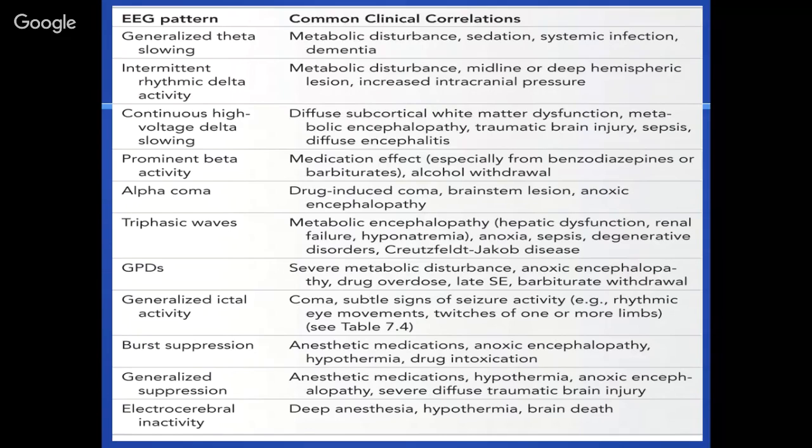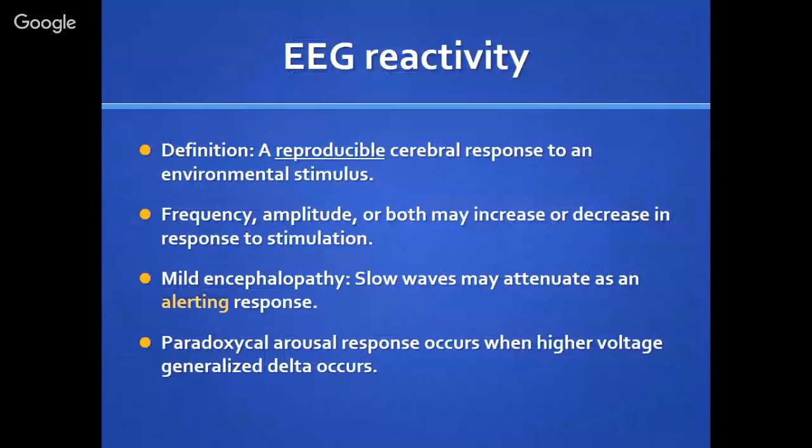And I also saw a patient with severe hyperacute liver failure, right? So no activity in the brain. Then after the transplant, they started seeing the activity. All right, EEG reactivity. So this is an increase of the brain activity after stimulating the patient. Okay, so we'll talk about that.